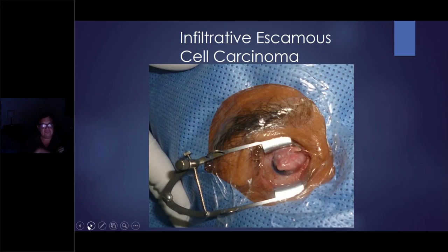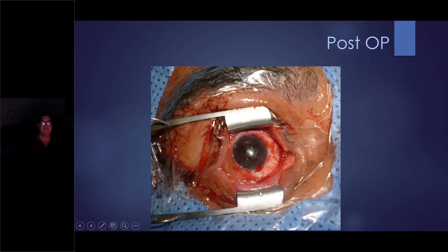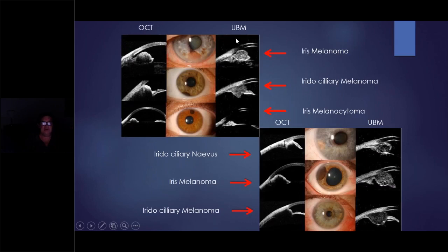Can you face this surgery? Can you solve this surgery without UBM? I think no, because with UBM, you have the idea that the tumor is not in the anterior chamber, is not in the cornea, and this is the final result. It's because you performed a UBM prior to the surgery. Also for tumors, UBM is much, much better than OCT. This is easier. Sometimes easy things are not complete things.